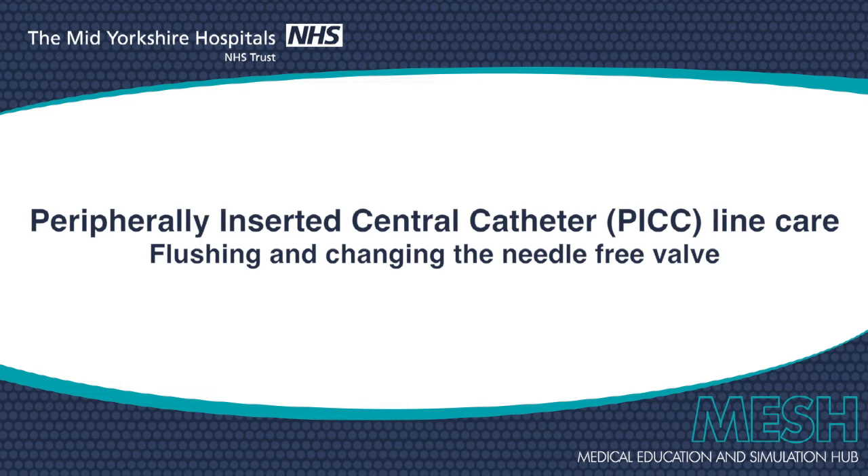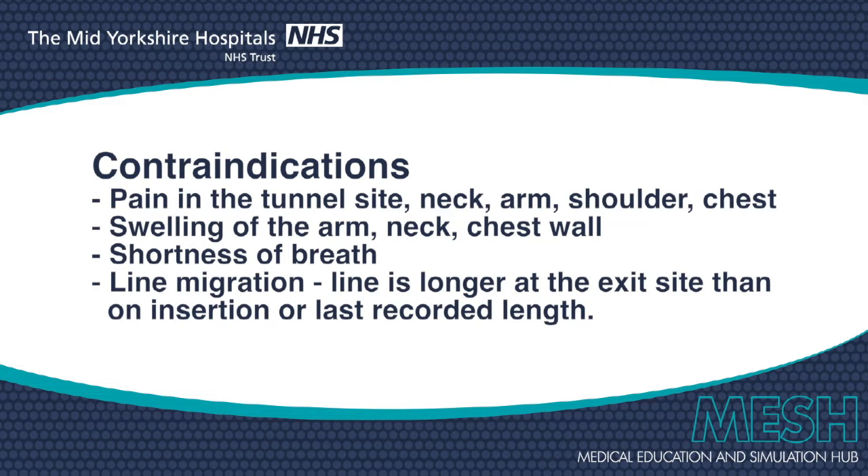The aim of this video is to show the practitioner how to flush a PICC line and change a needle-free valve. The practitioner should make an assessment of the appropriateness of the intervention, the wellness of the patient, any potential contraindications showing on screen now, and the patient's nursing, medical and line care pathway notes should be reviewed.